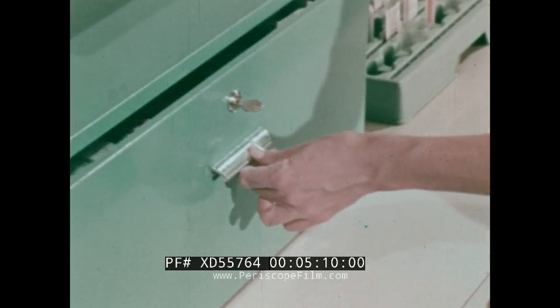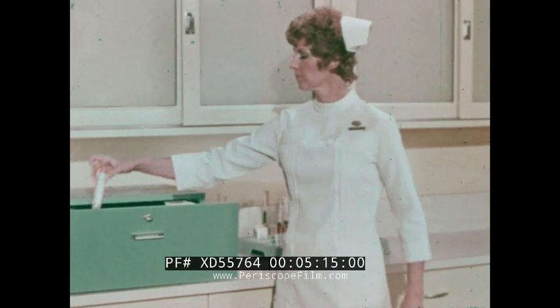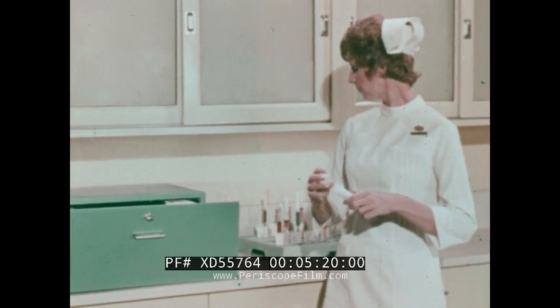When a separate syringe and separate needle is used, the separate syringe is selected and opened in the same manner as a syringe needle combination unit. Remember, as you break the heat seal, you assure yourself of the sterility of the unit.